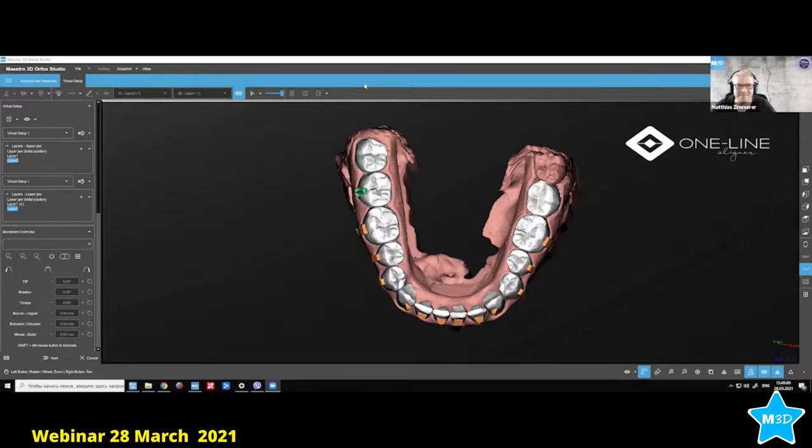So this is the newer Unis clear aligner light cure resin. What manufacturer would this be? This is Unis, who does the printer. Yeah, okay. They just sent one to me to see how it works out. So we'll be printing 2 or 3 aligners next week. I can just post how it came out to see the results.